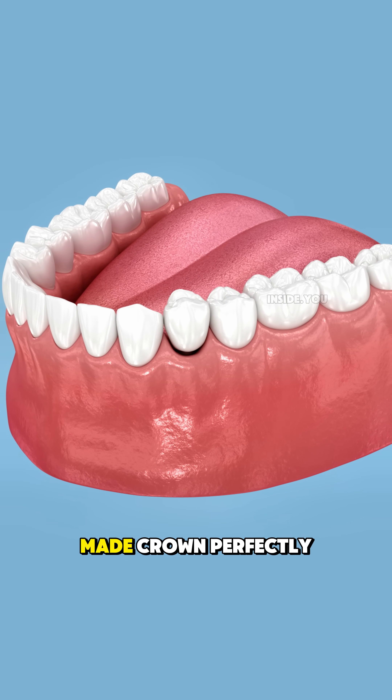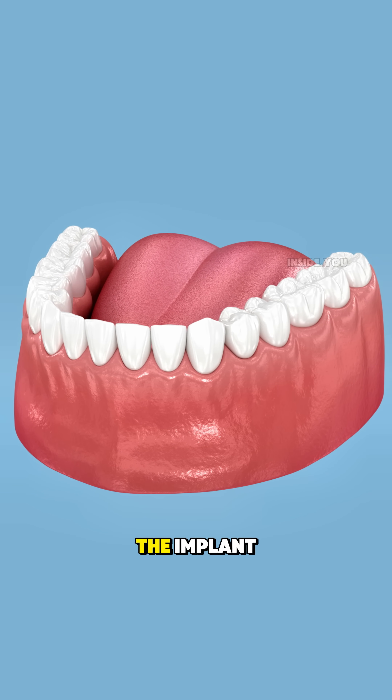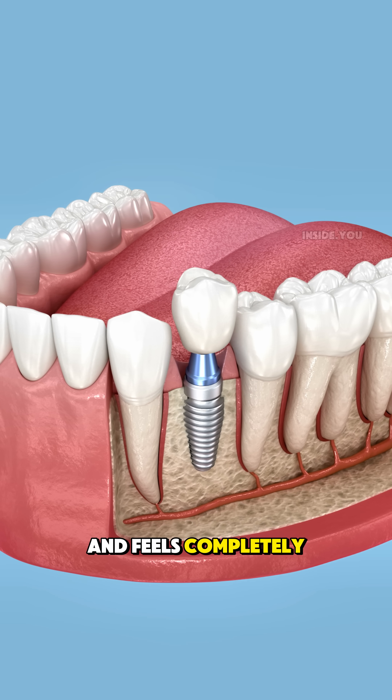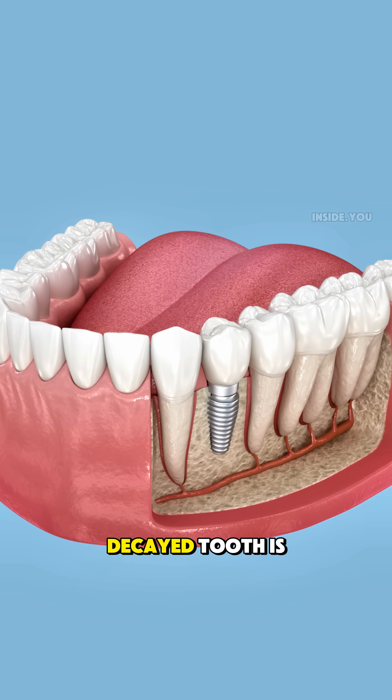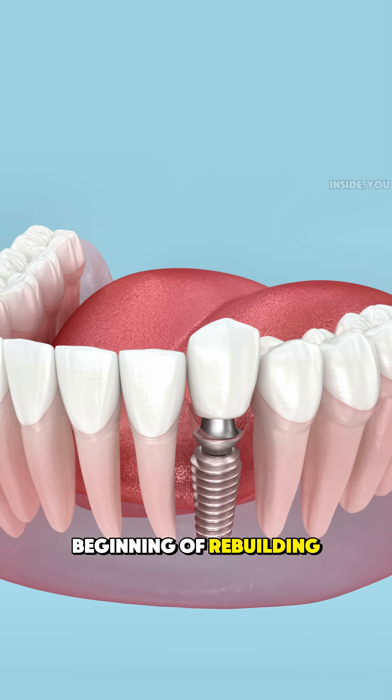Then, a custom-made crown, perfectly matching your other teeth, is attached to the implant. The result looks and feels completely natural. So when a decayed tooth is pulled out, it's not the end — it's the beginning of rebuilding your smile.